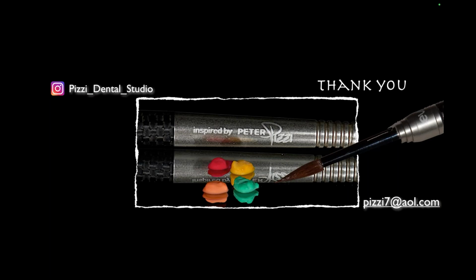Sometimes I need to modify my dentin with adding some opacious. I can mix opacious dentin and dentin, right? There's no law against that. I can increase the opacity of my dentin a little bit, or I can choose a dentin that might be higher in value or higher in chroma. That will be more reflective or more absorbative, right? So I know everybody always wants a straight system, and I'm going to be wishy-washy and tell you it's really so dependent on that per case basis. Yeah, I would imagine so.